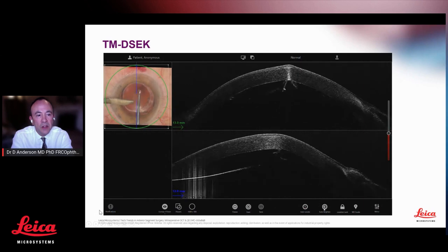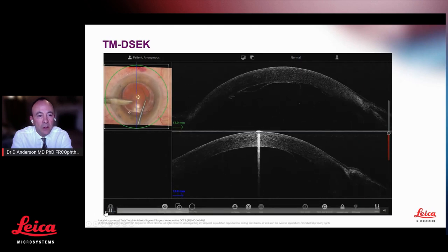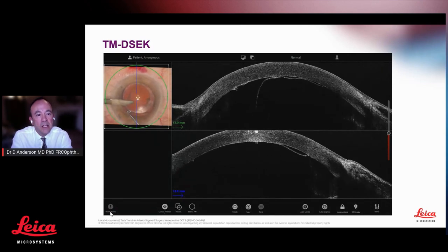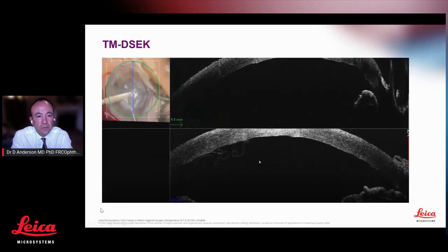There we are. You can see visually there on the screen the folds of Descemet membrane. Okay, next slide, please, Shio. And I think here we can see in the bottom slide in particular, at the left of the screen, that very nicely scrolled Descemet membrane.